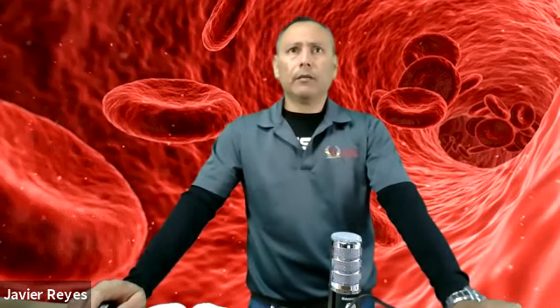Thick blood smears. Again, these can be used for several tests, including malaria. They're diagnosed with the presence of organisms in the blood. A very large drop of blood is placed in the center of the glass. The drop is spread with the corner of another slide to cover slip until the size of a dime.